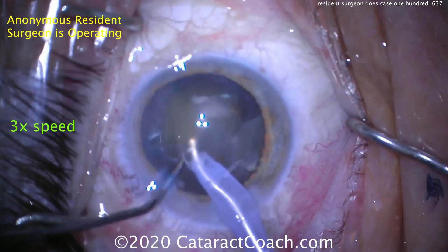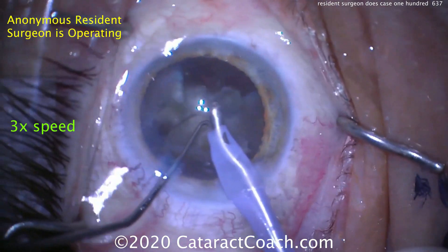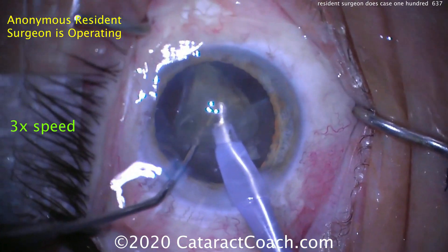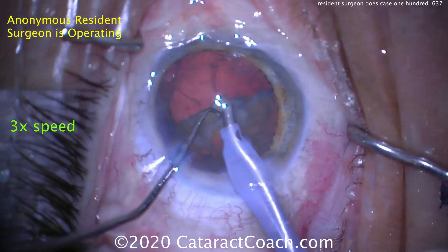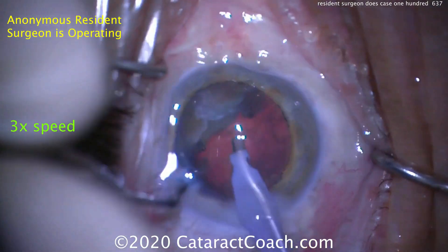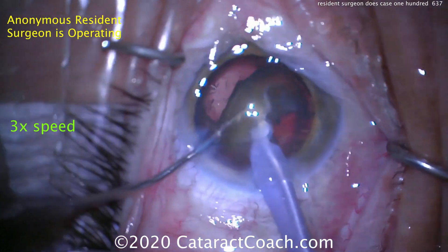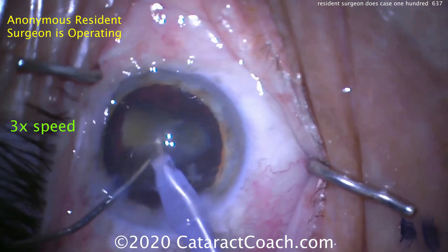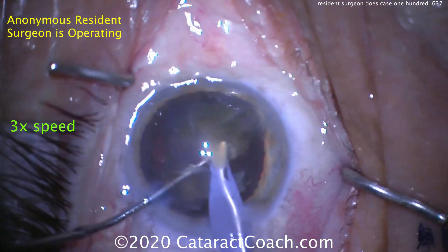Here's the first quadrant of the nucleus brought up to the iris plane. This looks pretty good. So what have we seen in this case that we've liked? The draping's great, the incision was pretty good, the capsulorexis was very good, hydrodissection was carried out nicely, and the divide and conquer technique is pretty good as well. Now here's the last piece of the nucleus — just chopped. So this is grooved twice to make two halves, then one half is made into two quadrants, and the second half was then just chopped.